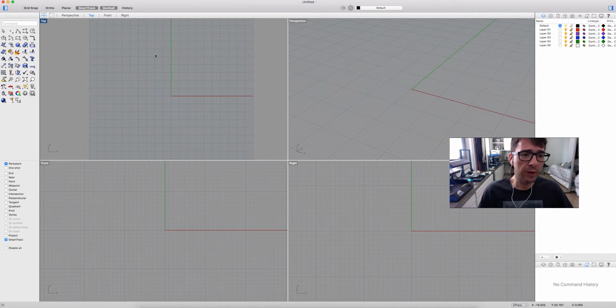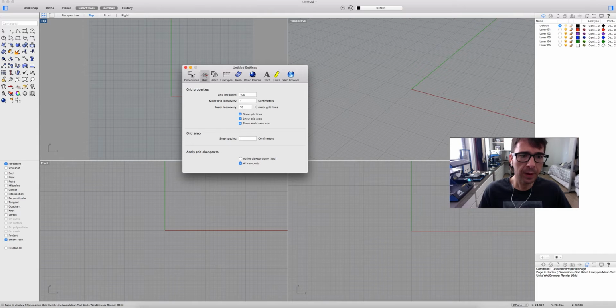We have our views here. I'm going to start with the top view, and I'm going to do a very simple tip. I'm going to select grid options, dimensions, grid, and here it says each grid is 1 centimeter. Maybe the unit will not be okay, but we can scale it by 10. So the grid line count, this is the tip I suggest.